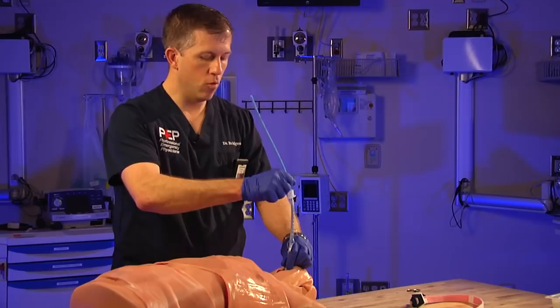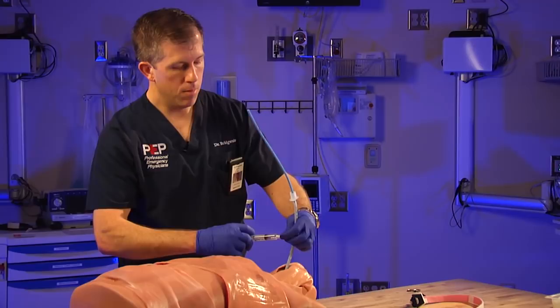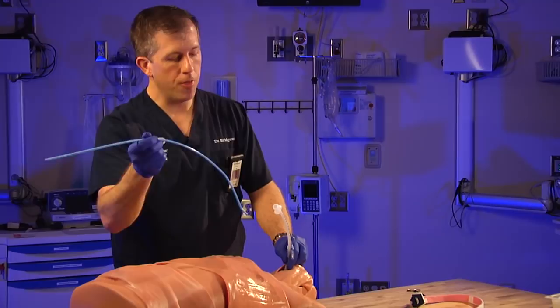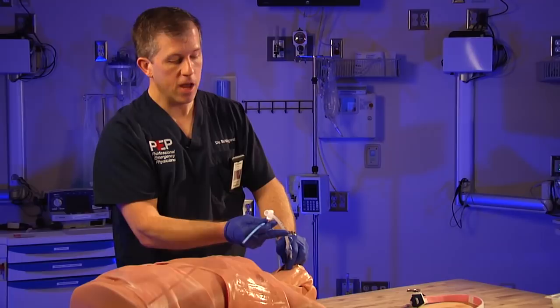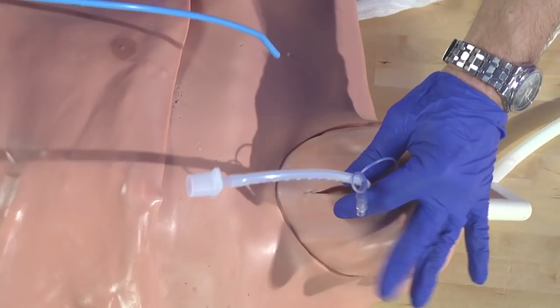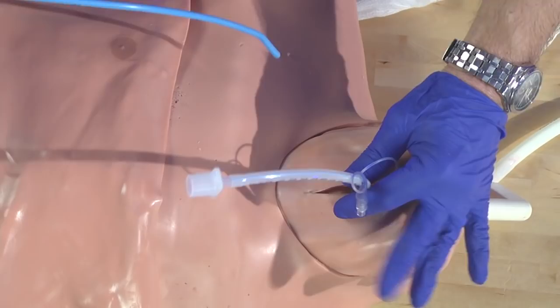You don't have to insert this very far — you'll have a large amount of endotracheal tube extending out. Once that's in, have your partner put approximately five to ten cc's of air in the tube to seal off any air leak. Then very carefully remove the bougie. Because you're using a five-oh to five-and-a-half endotracheal tube, there will be a little tension — be real careful you don't dislodge the tube. Secure the endotracheal tube to the patient's neck with your hand, then pull the bougie out in a nice even fashion.